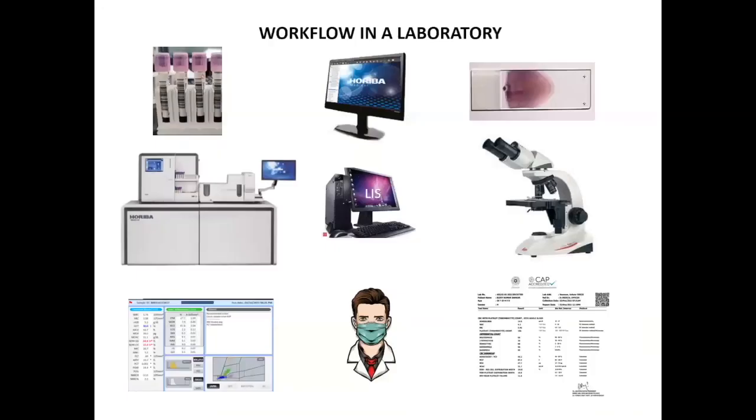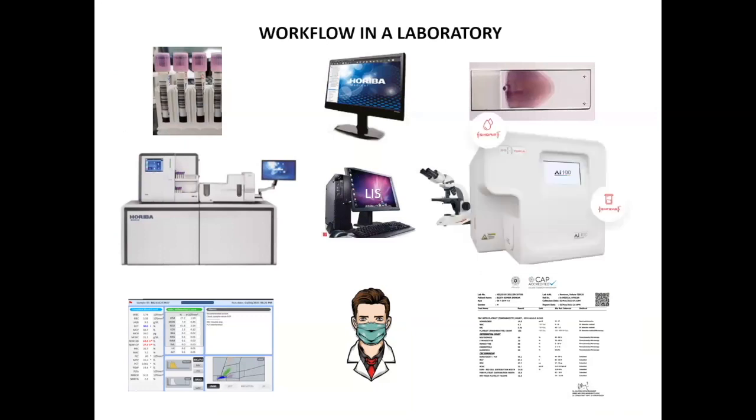So finally, the workflow of my lab, as I had told, starts with the sample, and if a slide is required, it ends up on manual microscopy. But now I guess this will largely be replaced by the digital morphology analyzer, the AI 100. As I have tried to emphasize the importance of this in these few slides, I hope people listening would largely shift to digital microscopy, and the role of manual microscopy would be lesser. Although being a proud morphologist, I will never give up my microscope, but yes, the role would be reduced.